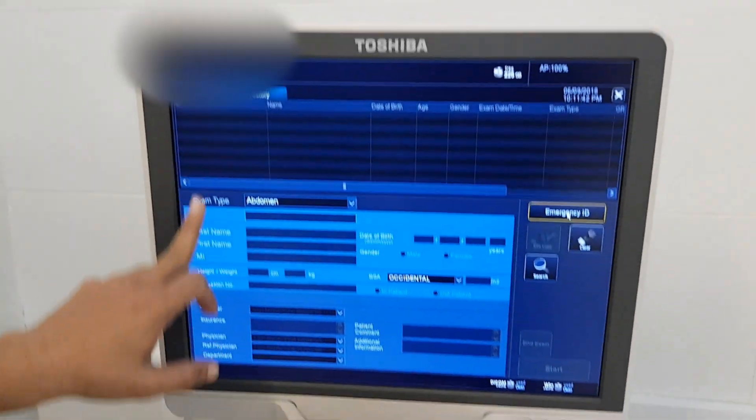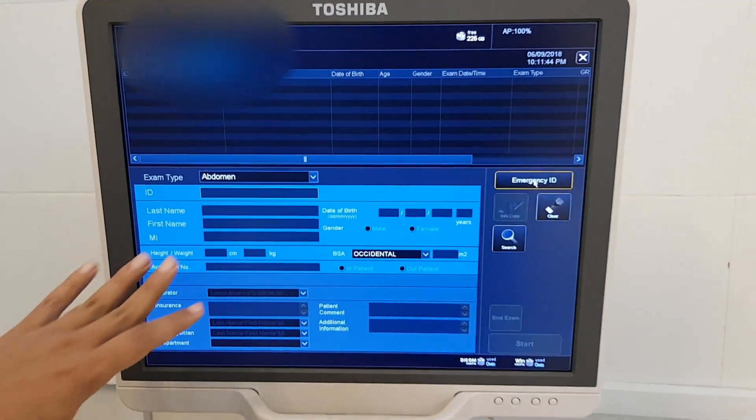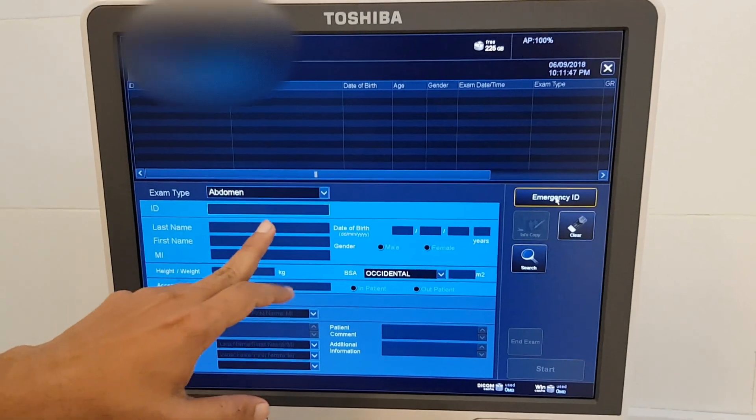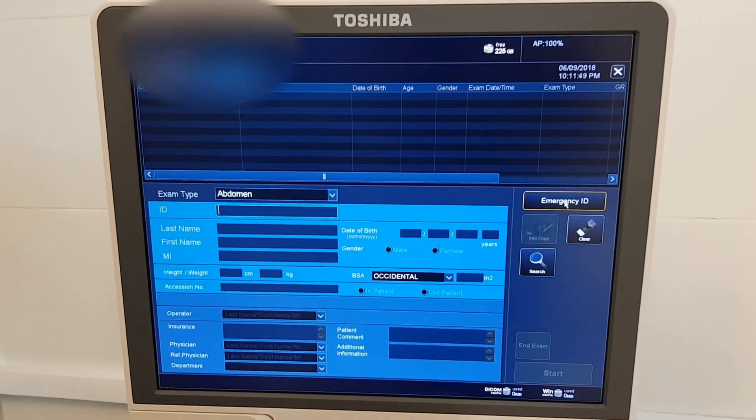This is the display screen — this is the patient information screen. You have the name of the patient, the hospital ID, and all of them are entered here.